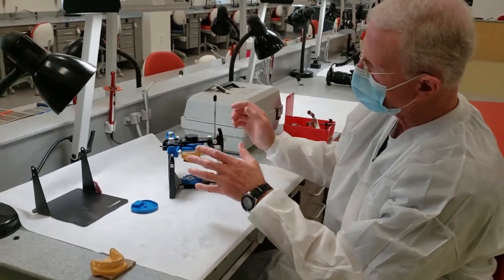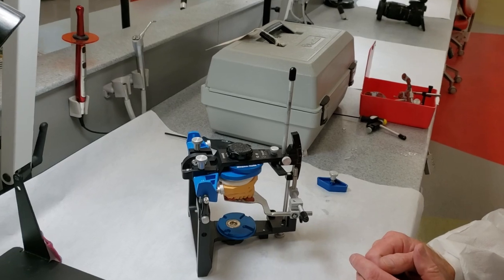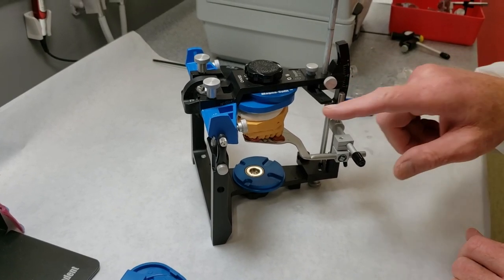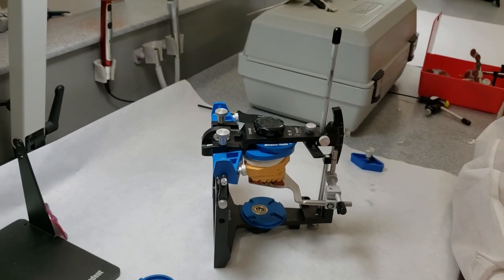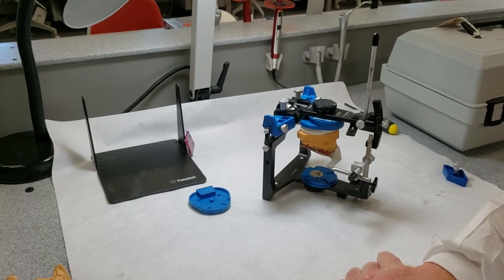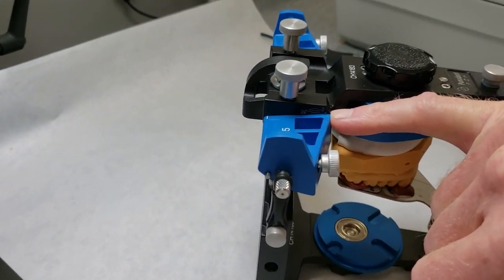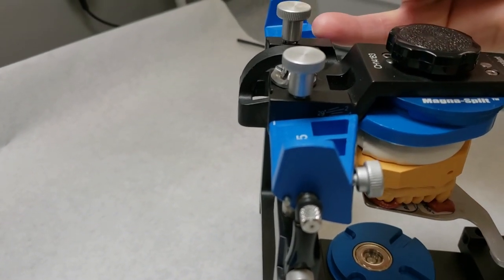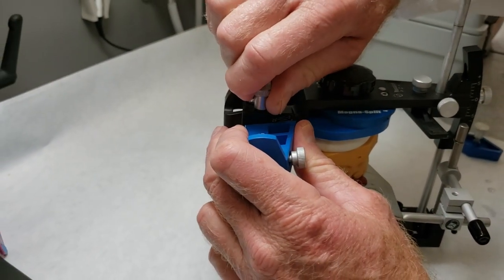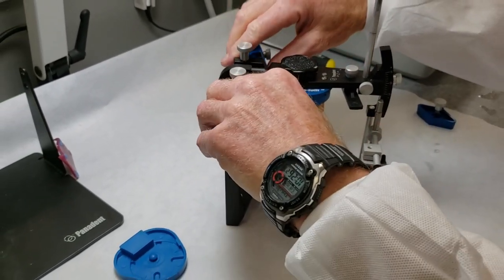One of the things I failed to mention before we mounted the upper: always check the settings on your articulator. Not so much that there's something magical about the numbers, but that things are firmly and securely in place with no wobbling. A good general rule for average condylar inclination for 99% of patients on these Panadent articulators is to have both condylar inclinations set at four. But before you ever start, just make sure these are snug so that nothing moves during the mounting process.